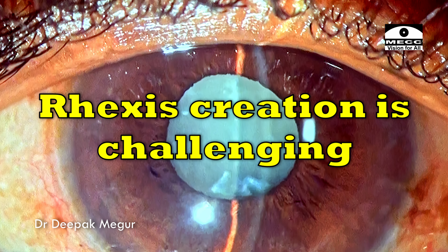As expected, the challenge always is going to be the rhexis creation. The nucleus usually is very soft and not difficult to manage. So, let's begin.